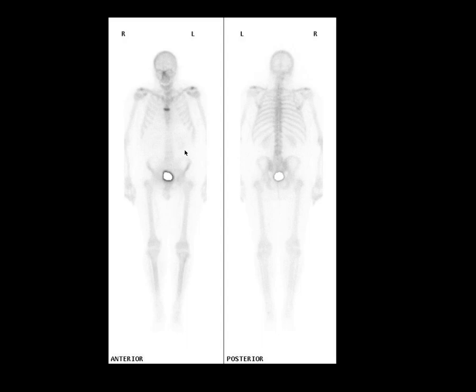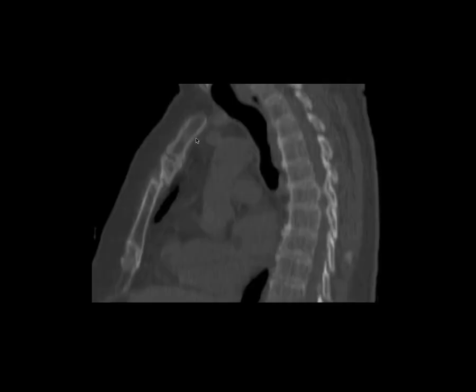Back to the sternum — the normal uptake was a small area of activity at the manubriosternal articulation, not always seen. But this appearance is rather different: a transverse band of activity. This transverse band appearance is often seen in the sternum or spine where there's a fracture. This patient actually had an ununited fracture of the sternum causing this appearance.